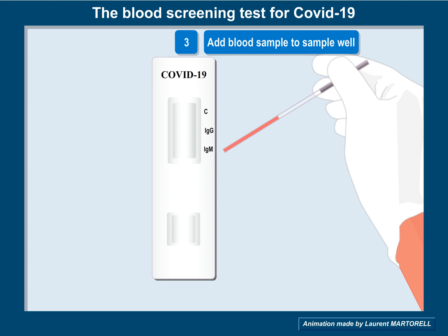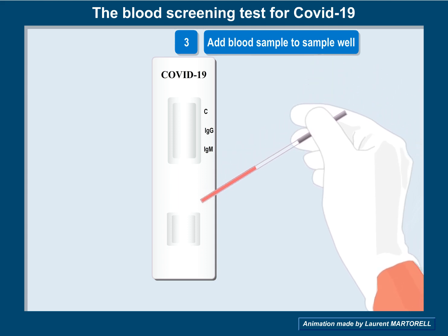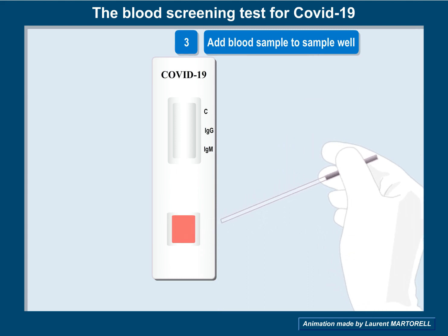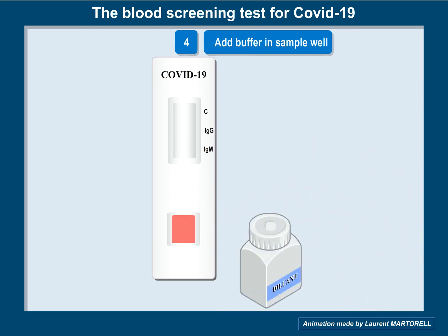Add a few drops of blood sample to the sample well. Then, add a few drops of buffer to the sample well.